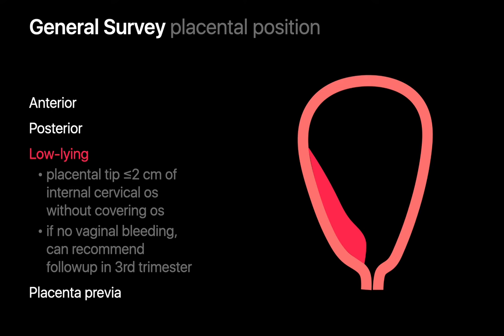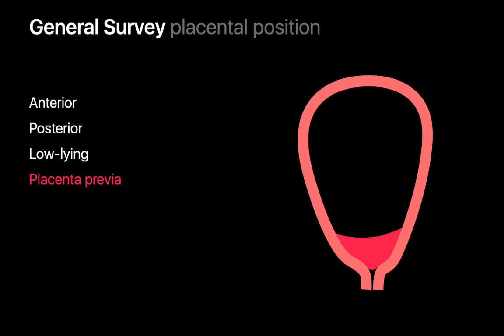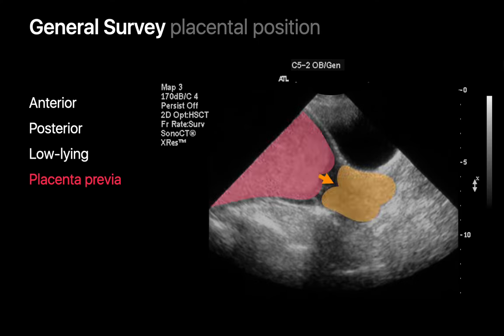In women with a low-lying placenta but without vaginal bleeding, we'll often consider doing a follow-up ultrasound during the third trimester. In this example, the placenta is posterior and its inferior tip is situated only a centimeter from the internal cervical os. Sometimes the placenta may cover the internal cervical os — this is placenta previa, as seen in this pregnancy.